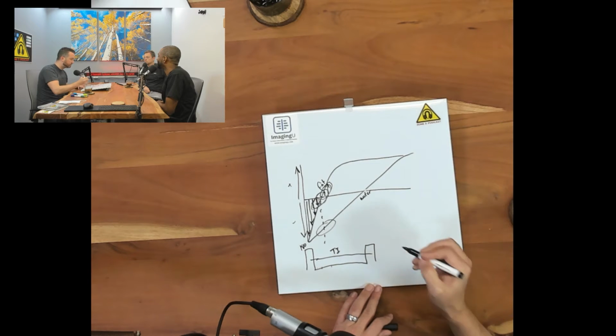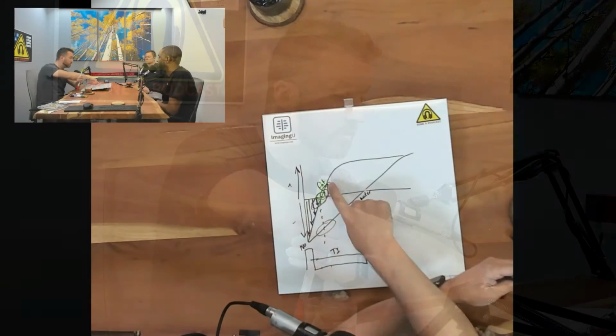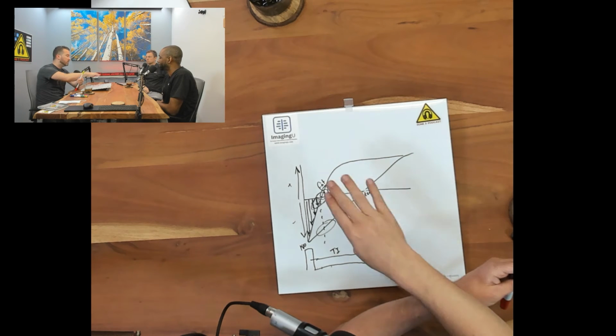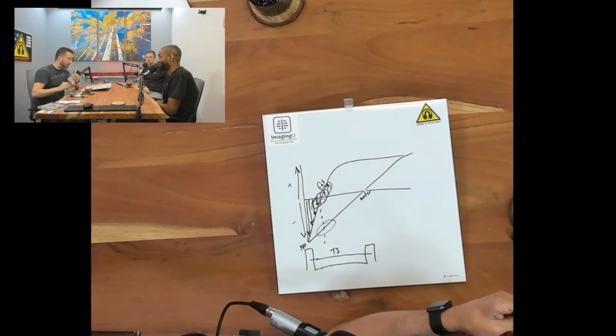So if you think about it, let's say this is fat and this is water. We gave them a 180, so they're down here, and fat is going to regrow really, really fast. That's what we're seeing along this line. There are going to be things in between, but fat and water are always the polarizing ones: shortest T1 recovery time versus longest T1 recovery time, shortest T2 time, longest T2 time. Thank God for that, because that's why we have a job, right? That's why we have a job, yeah.